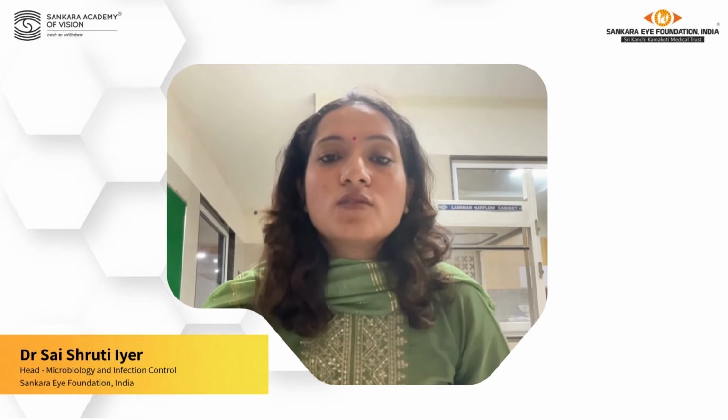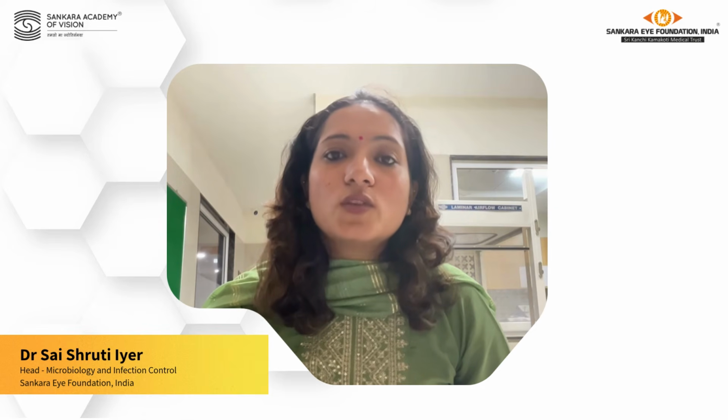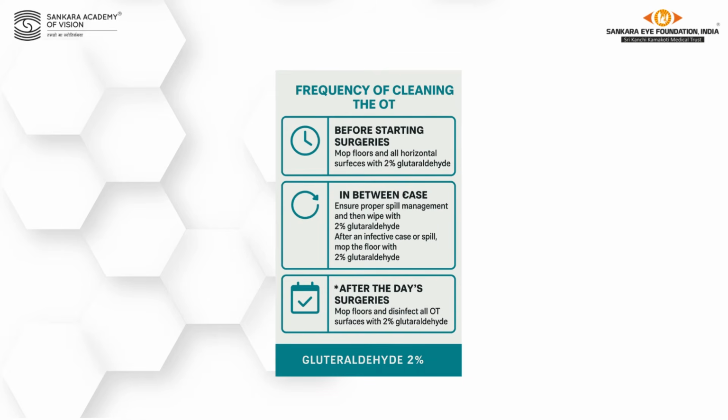Before you use glutaraldehyde, the surface should be free of any organic debris. So make sure that the OT is cleaned with warm water before you apply glutaraldehyde. When should we clean the OT? What should be the frequency?